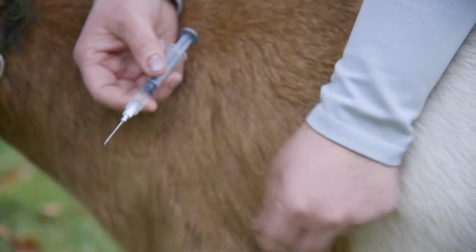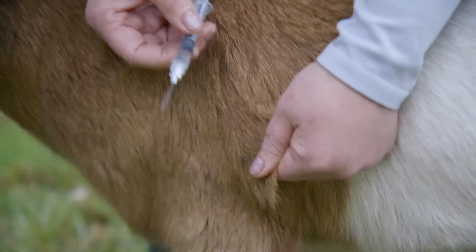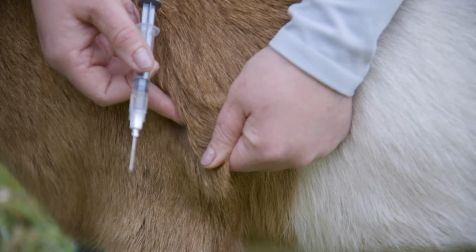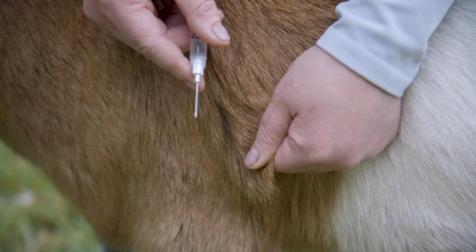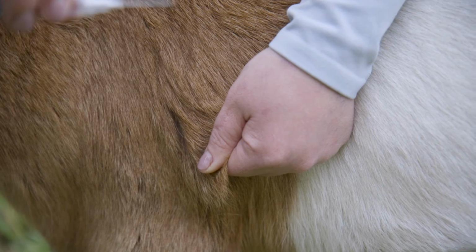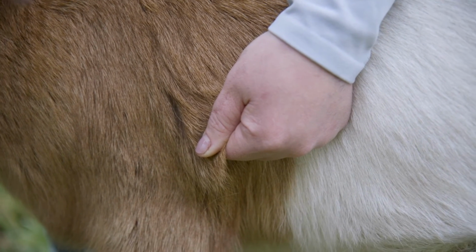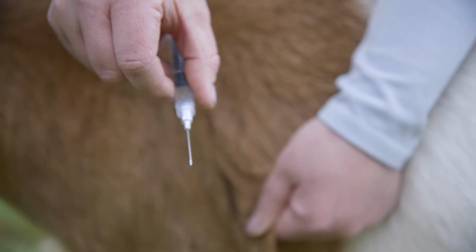You wanna make sure that sharp point is towards the goat, the bevel is up, meaning the hole is facing towards you. Okay, so going in this lower area, I'm gonna pull the skin away as I discussed so that I'm creating that space between the body wall and the edge of the skin. The bevel is up, so the hole is facing towards me. And again, remember, we have that sharp point on one end. You can see the angle of the needle, and then the bevel is the hole facing forward.